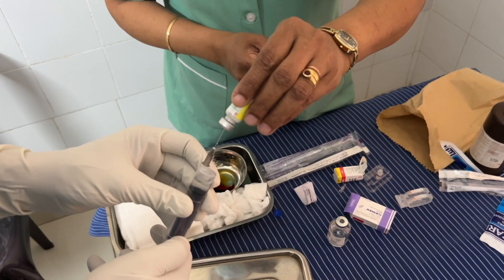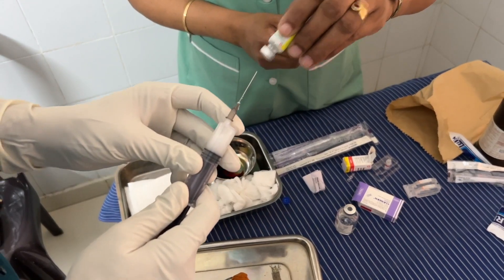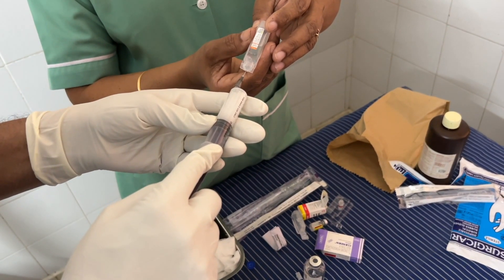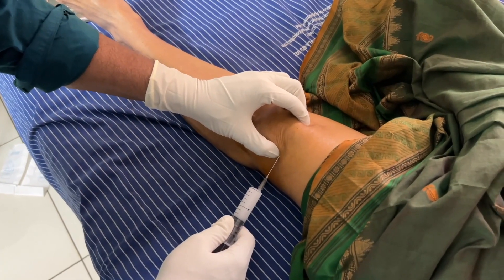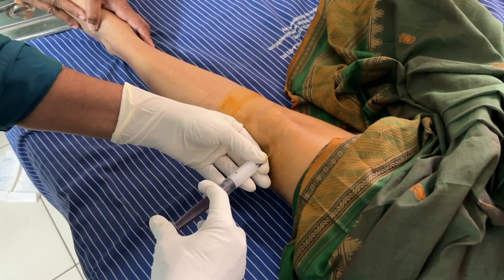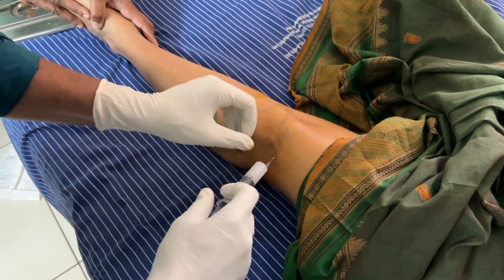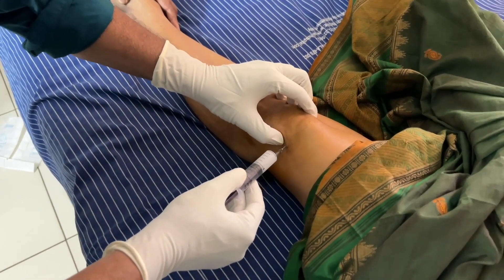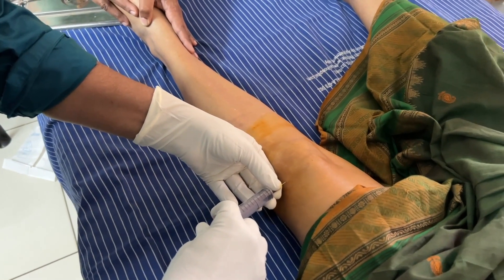The cocktail consists of xylocaine, a very small amount of Kenacort, then 30 micrograms of clonidine, and water for injection — diluted to 0.5%. This shall be given intra-articular first, which will also act as a local anesthetic, because dry ozone in itself is a little painful. We ensure that the joint is intra-articular and we use a thin needle so that the injection is rather pain-free.